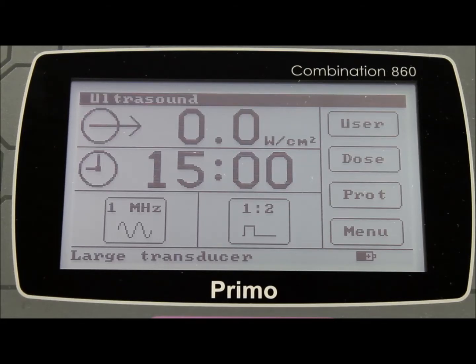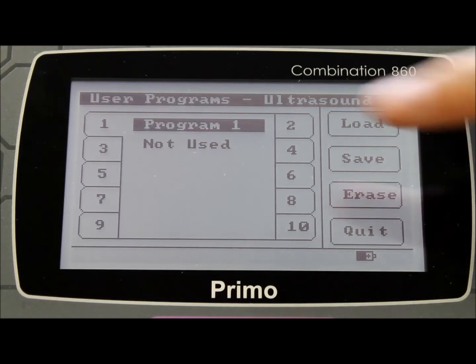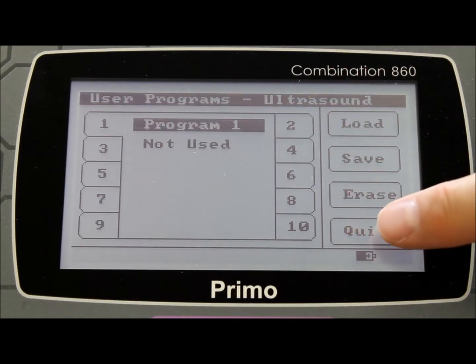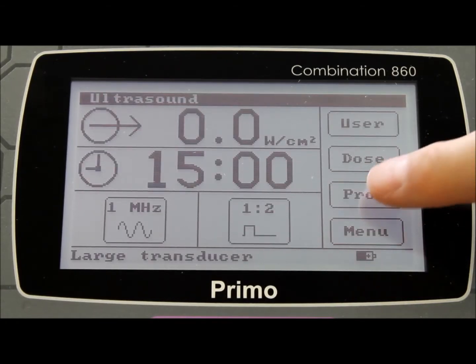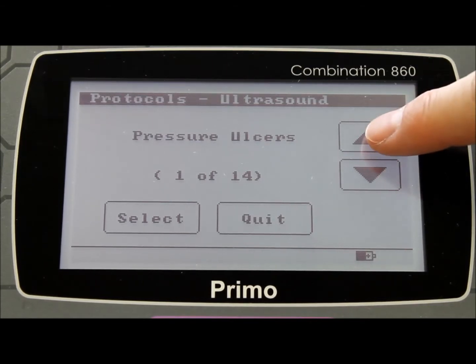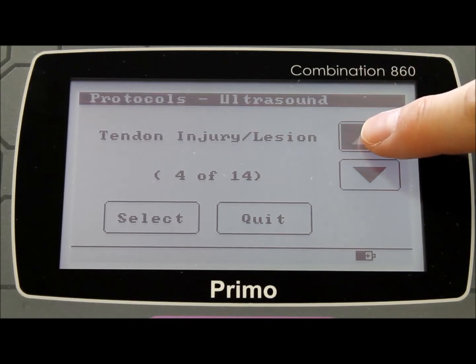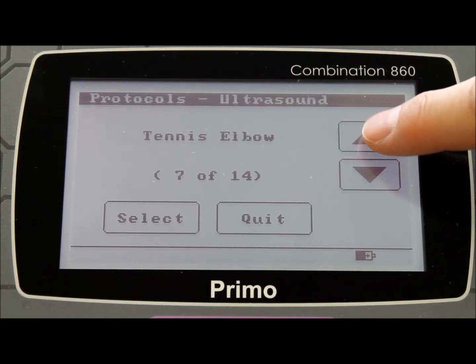There are several other options available with the Primo range, such as the ability to save and use up to 10 user programmable treatment regimes. A unique feature of the EMS Physio protocols is that each setting has been based on published clinical evidence, collated and referenced specifically for EMS by Professor Tim Watson, who is based at the University of Hertfordshire, north of London.